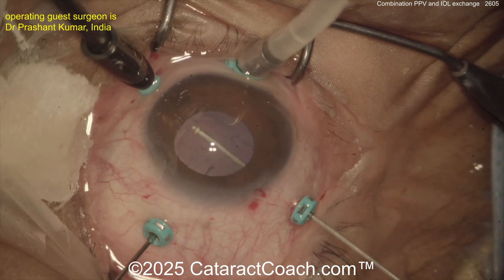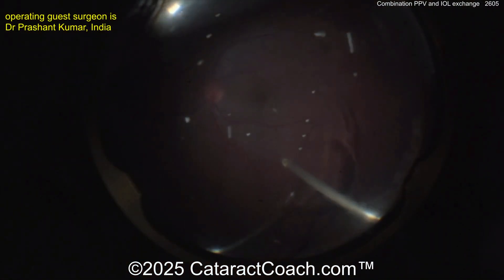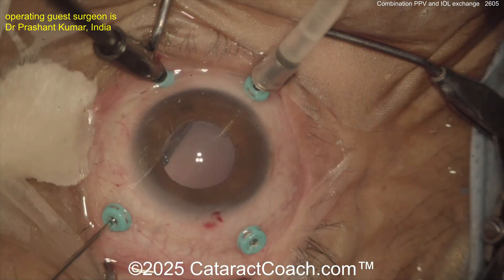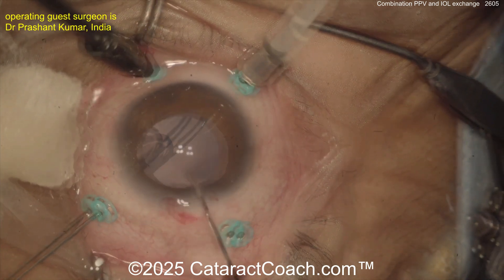We just saw the surgeon pull out a CTR — that was crazy. I didn't even know where it was hidden. When CTRs fall back into the vitreous cavity, they can be very challenging to retrieve. It's just like explanting an intraocular lens — in some ways actually a little bit easier because you can just grasp it and pull it up into the AC. It's flexible and easy to explant.